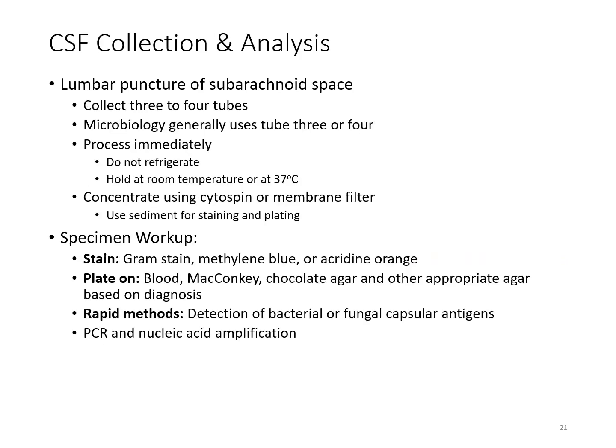Now, just as a reminder, those plastic collection tubes do have numbers on them. You have to be very careful because a lot of times they're a little harder to see, so sometimes they're not always collected in the proper order. The people collecting it, the physician and nurses or whoever's assisting, will handwrite on those labels and put them on the tubes and won't necessarily go by the actual number that is engraved on that tube. So you need to be very careful and make sure that you are testing from the proper tube.